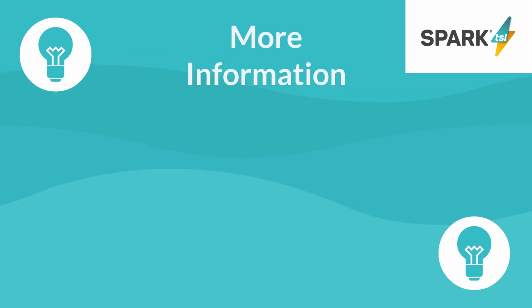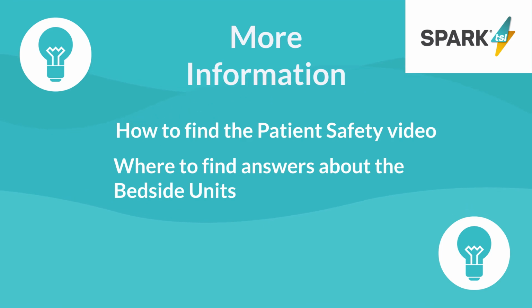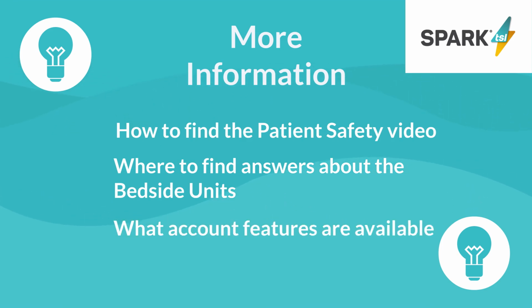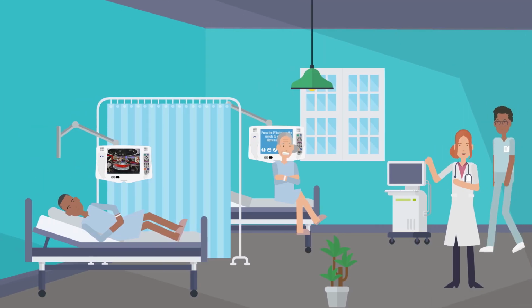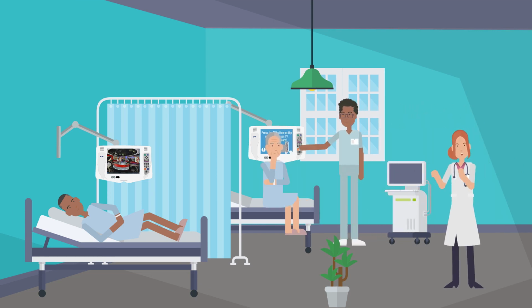This section will show you how to get to the patient safety video, where to find answers to common questions, and what account features you have access to. Never been to hospital and want to know more about being a patient? With the Bedside Units you can watch the patient safety video.